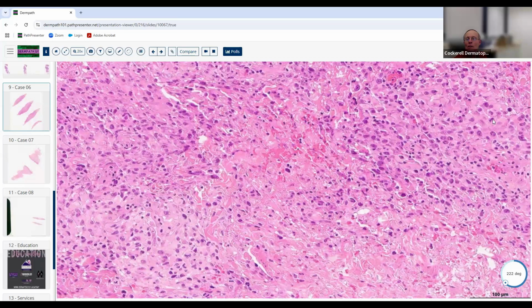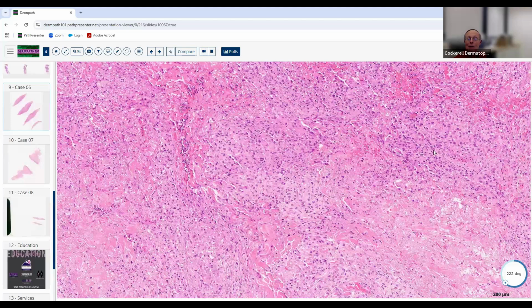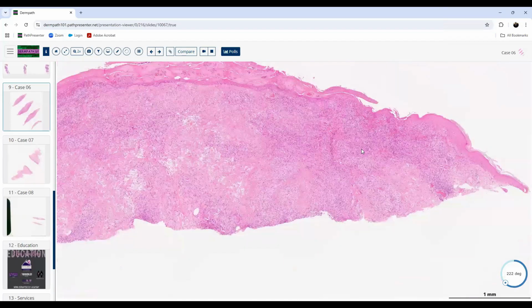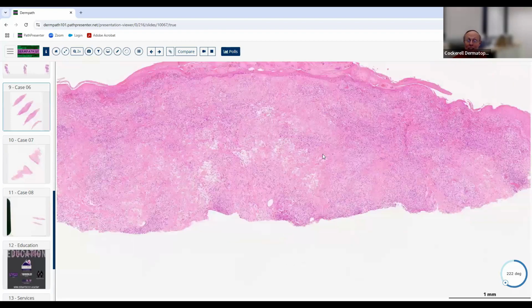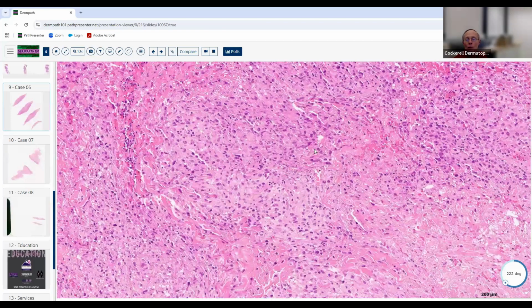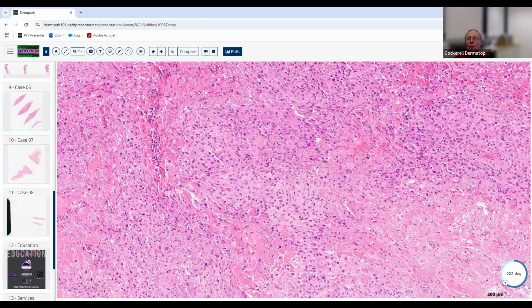Then you do this biopsy, and boy, all these atypical cells, it looks malignant when you look at the cytology, but it's coming and going. The patient seems to be happily ever after. Yeah, I guess things that come and go, something like lymphomatoid papulosis. Yes, this is lymphomatoid papulosis. This is an example of what these lesions often look like. This is one of the necrotic lesions that you get with lymphomatoid papulosis.